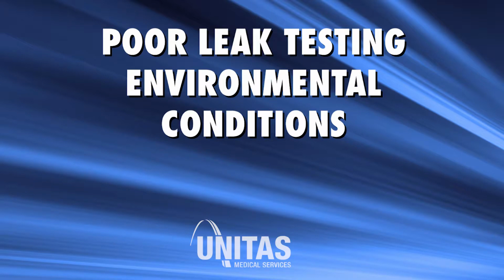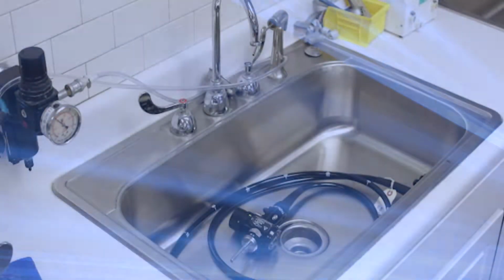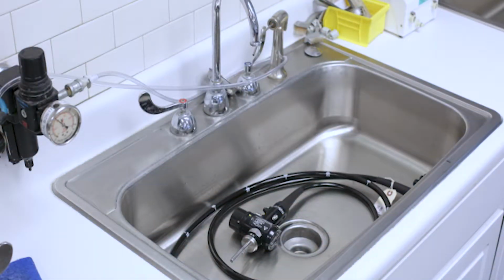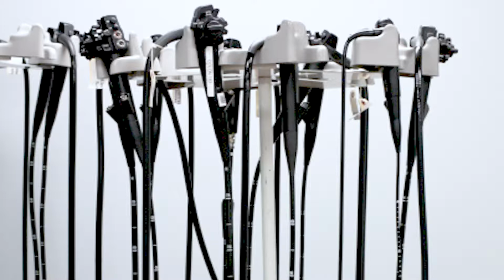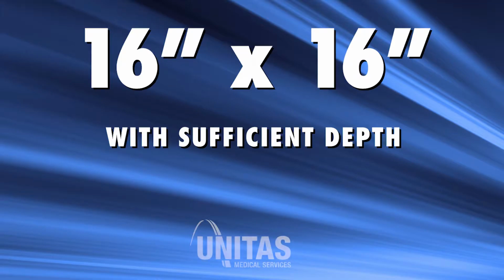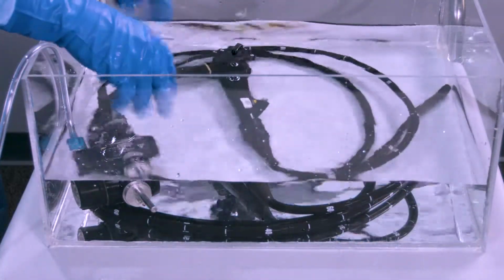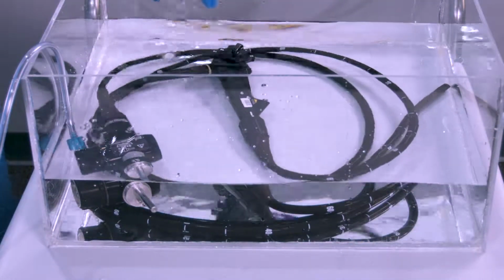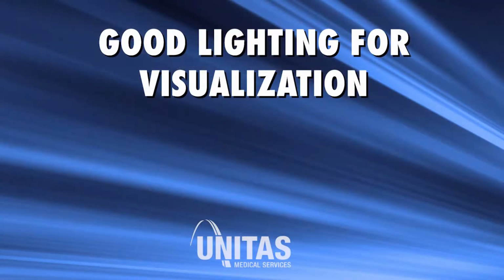Poor leak testing environment conditions. Sink size and lighting are key environmental elements. If the sink is too small, the scope may be coiled multiple times, greatly reducing visualization. This is especially true for large diameter endoscopes. The sink should be, at minimum, 16 by 16 inches and of sufficient depth. Slow water pressure and long fill time may encourage underfilling the sink for all reprocessing steps. Also important to visualization, the lighting must be sufficient for detecting small air leaks.